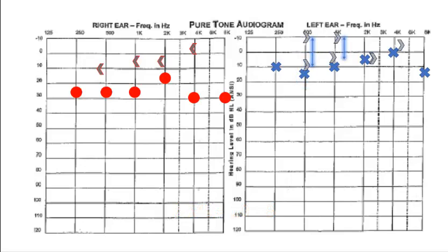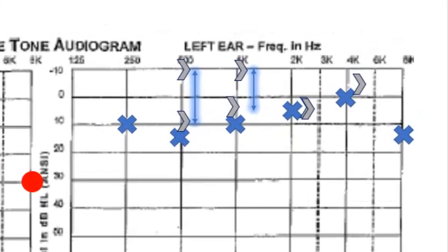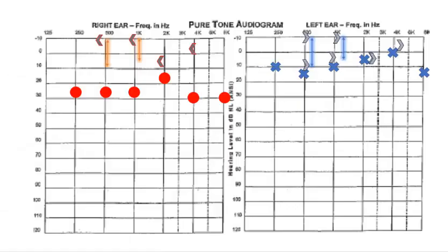Not so fast. Don't forget we'll be using TDH headphones to deliver the masking noise. Having the phone in position to deliver the masking noise may create an occlusion effect. Sometimes it could have a dramatic effect on the non-test ear's ability to hear bone conduction signals. If the unmasked bone conduction results were actually coming from the left ear, as suspected, it could shift the bone conduction results by a dramatic amount. So our overall bone conduction results that we're trying to collect with the device on the right side could be improved by these amounts simply by having the headphone in place on the left side.